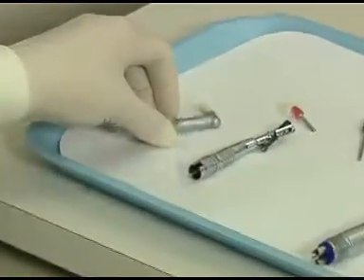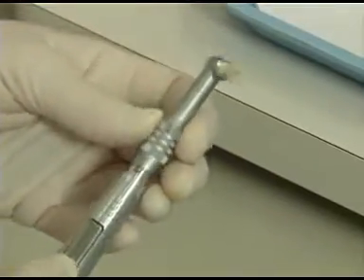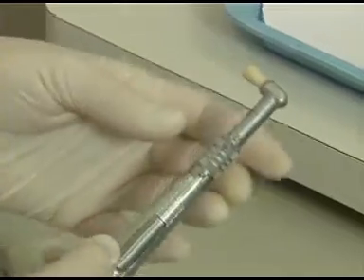Identify the prophylaxis angle, also referred to as the prophy angle. Slide it onto the motor base, making sure it is secure.